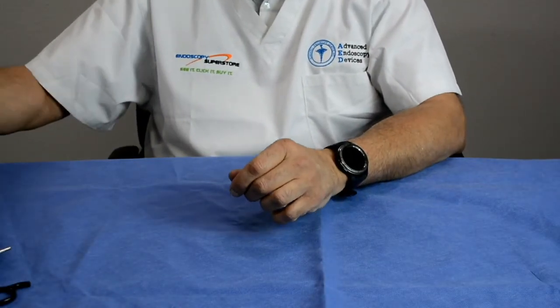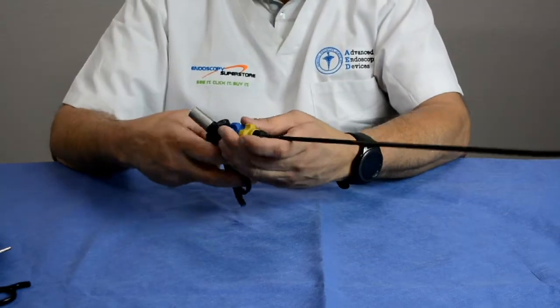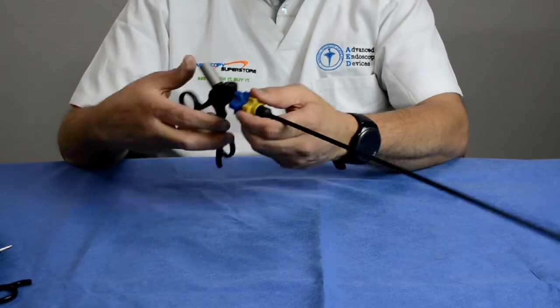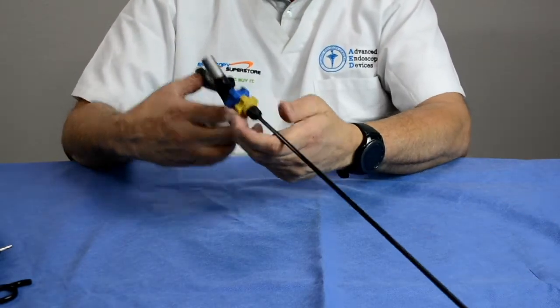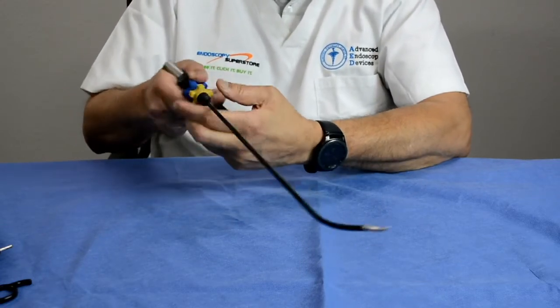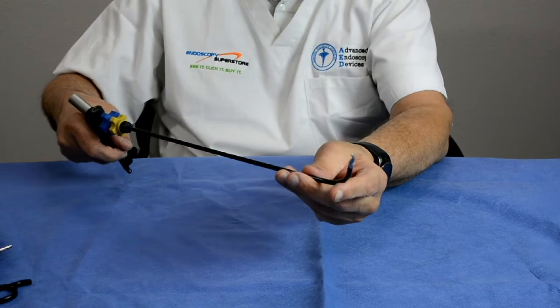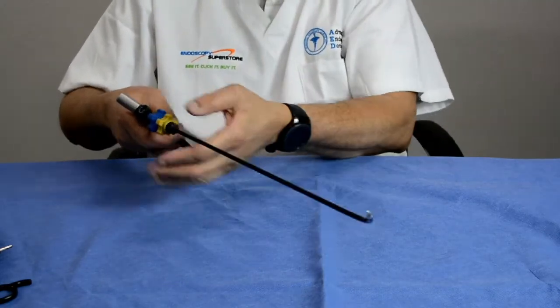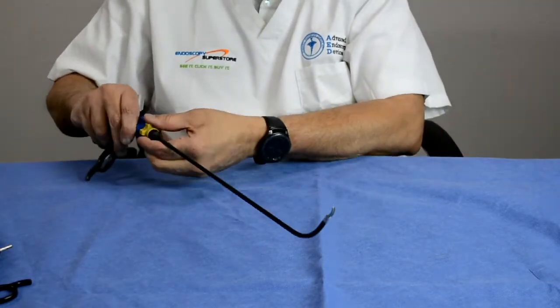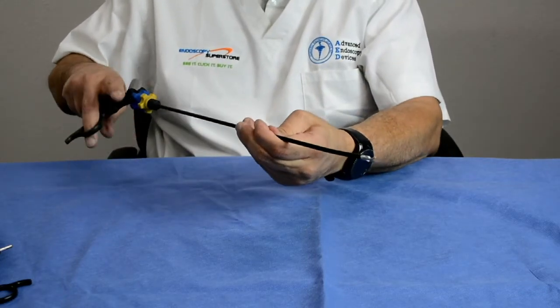Doctors then asked for this capability in a five millimeter instrument. This next evolution is a standard forcep that is totally rotatable and can open and close, but when you need to reach a very difficult position, you turn a knob and actuate the distal tip to the angle you want. This is essentially like having a straight forcep that can turn inside the body to get into the position you need. This innovation is patented by Advanced Endoscopy Devices and is available on Endoscopy Superstore.